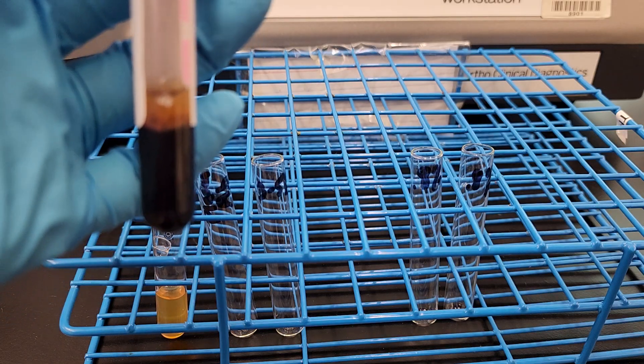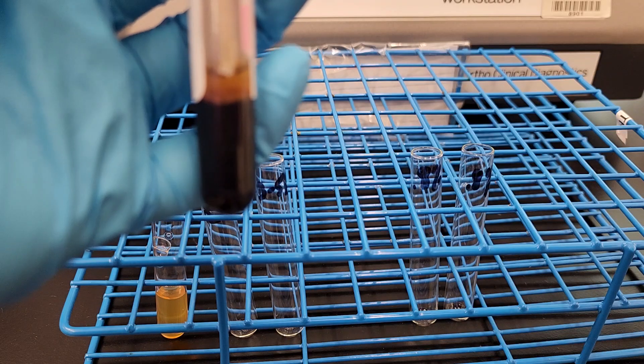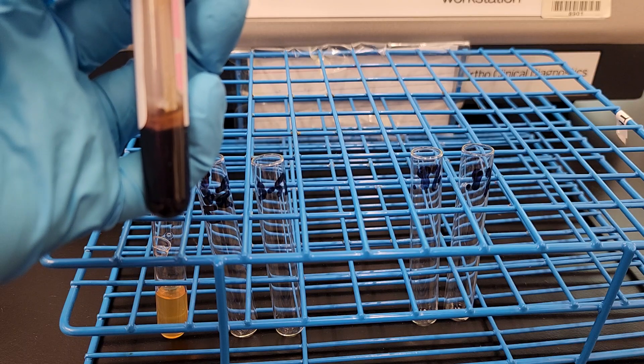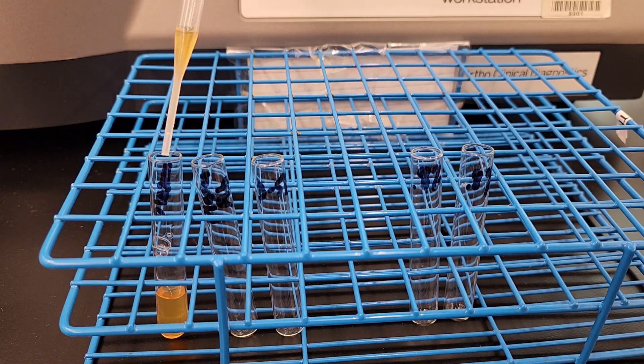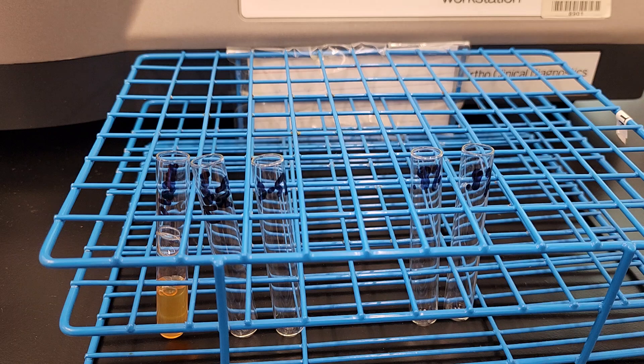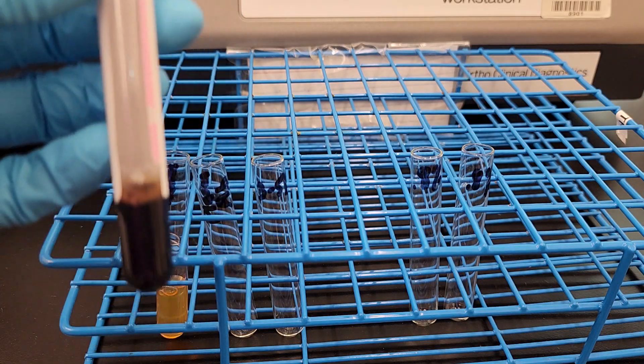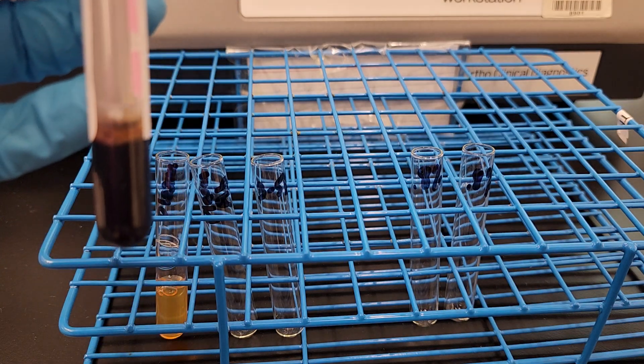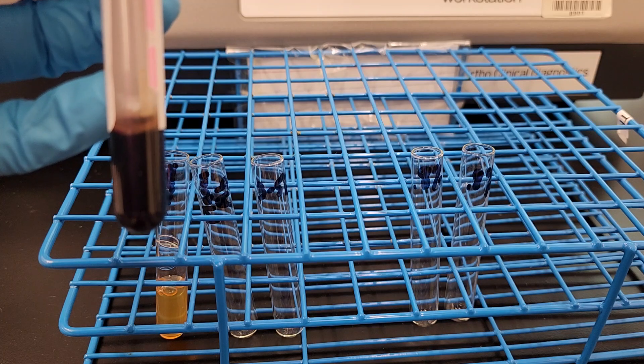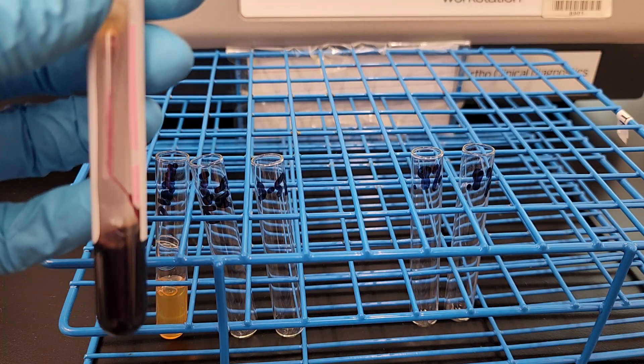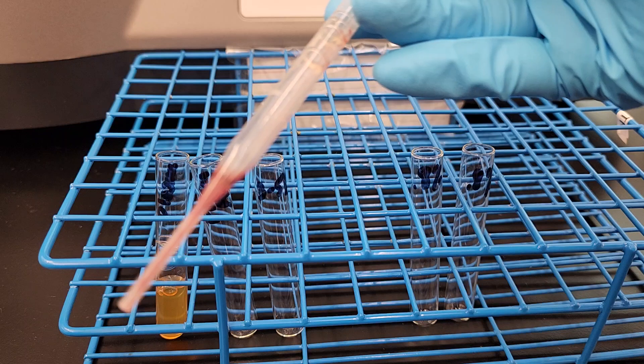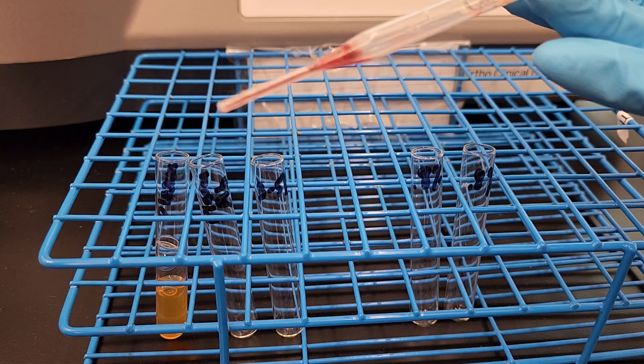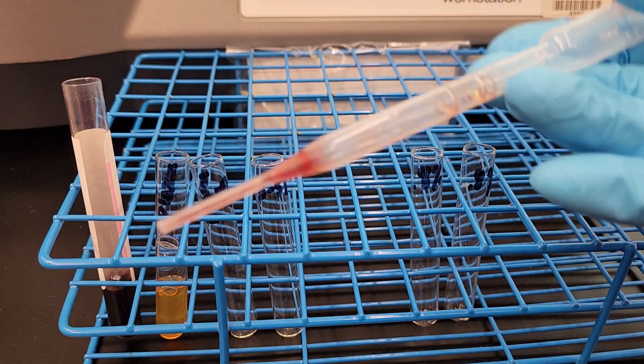So this is where everybody gets pretty much messed up when you get closer to that buffy coat. So I still have my plasma, but see we have a little bit, the camera's not really picking up, but also a little bit of liquid right above the cells. So if I wanted to pull that up, I might pull up some red cells. And that's what ends up happening with students. And then they put it right in the plasma and then it's messed up and you have to mitigate from that.